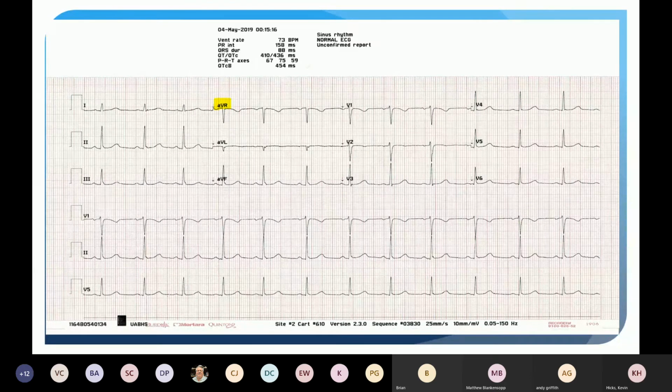So very concerning. The uncool thing about this is most 12-lead monitors aren't going to pick up AVR elevation and call it a STEMI. So you're going to have to recognize that and pass it on to the receiving facility so that a doc looks at it pretty quick to see if that's somebody that needs to go to the cath lab or if somebody else needs just resuscitation to kind of get the heart out of that strain pattern, okay?